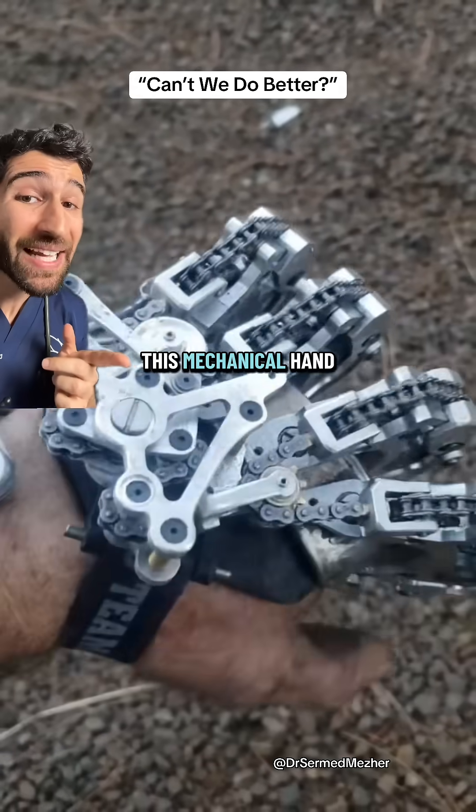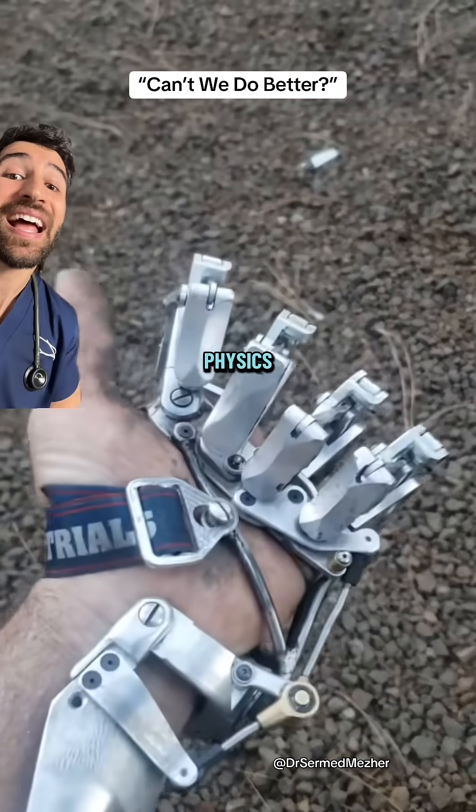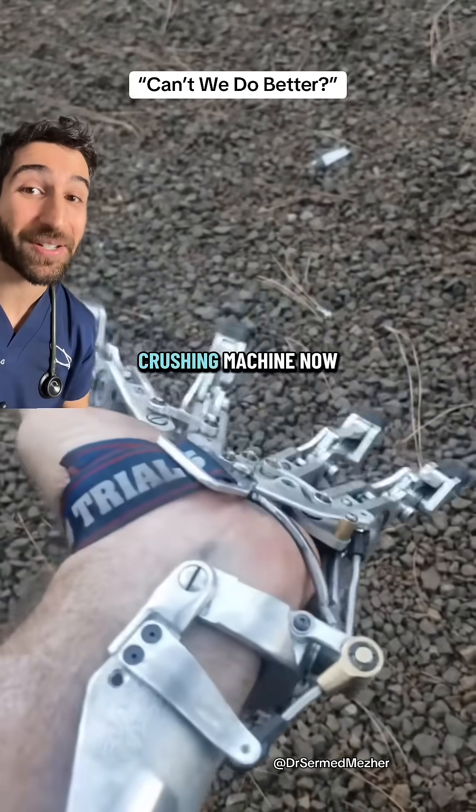That led him to make this mechanical hand, which is operated with no battery, completely through engineering and physics, and has been nicknamed the orphan crushing machine.